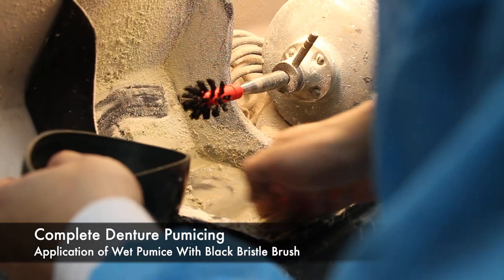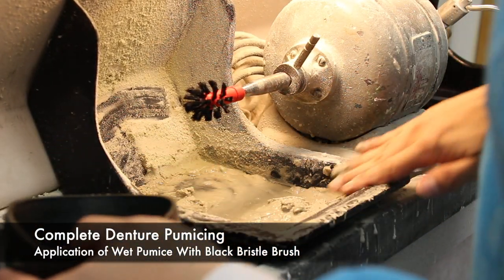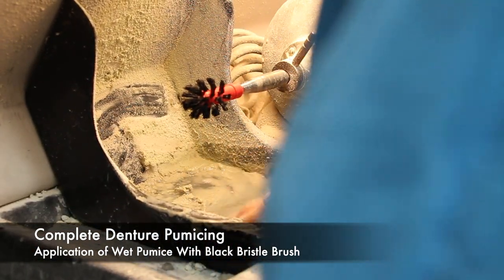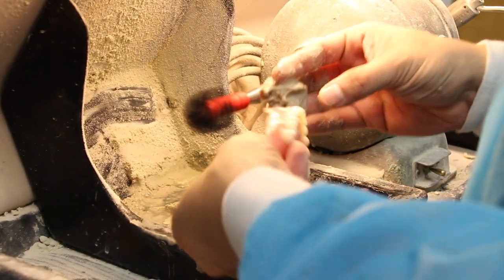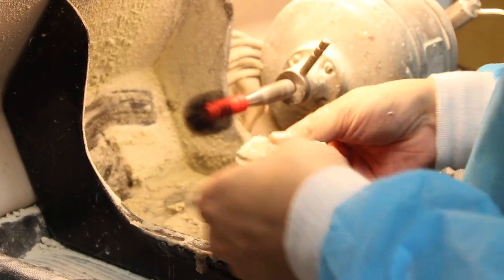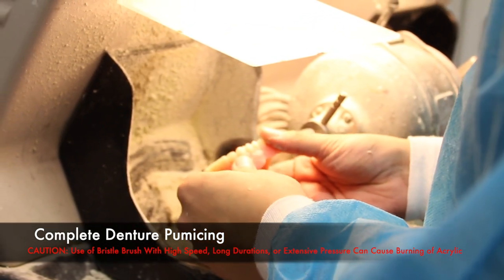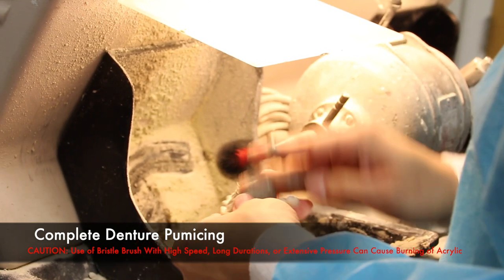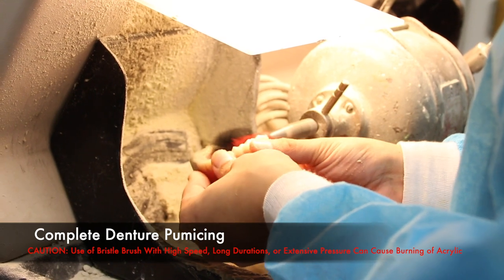To begin our complete denture polishing procedures, we start with pumicing. What is pumice? It's a mixture of sand and water, and it acts as a wet sandpaper. Initially, we apply this with a black bristle brush. Before we even touch base on technique, I want to send out a caution. The use of a bristle brush with high speeds, long durations, and extensive pressure can actually burn your acrylic. So use this tool with caution.